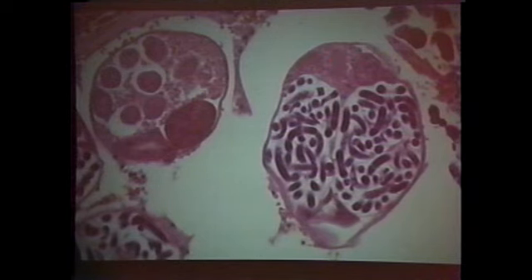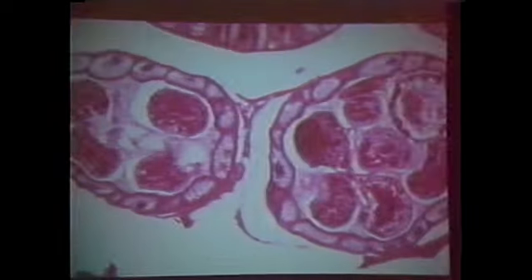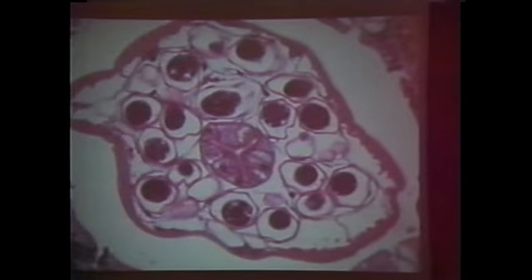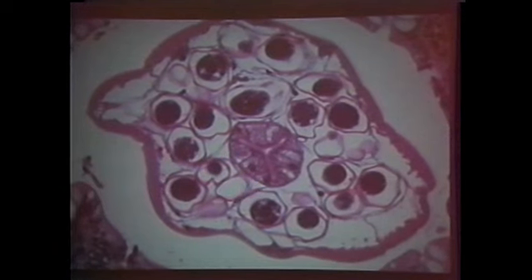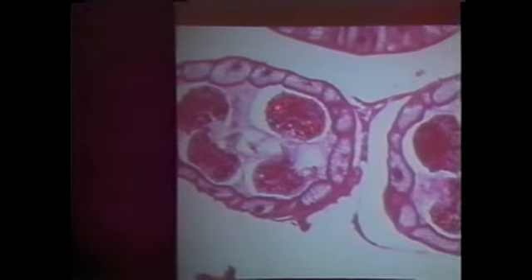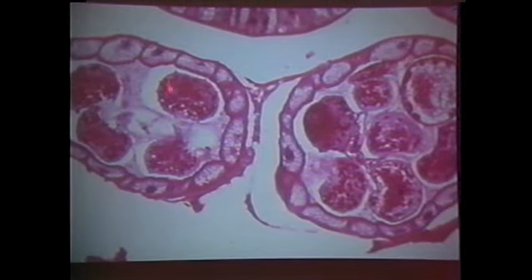Notice how the females are often larger than the males. And here are little larvae, so it helps you say that it's a female. Females have eggs. You're not going to see them in males. And look, here we go, eggs. Use what you learned in vet school. Sometimes you can identify the egg within the female and therefore identify at least the group of the worm by just looking at the eggs. Here are some reddish structures that have red globular yolk in them. What do you think they are? It's eggs. This is a female.